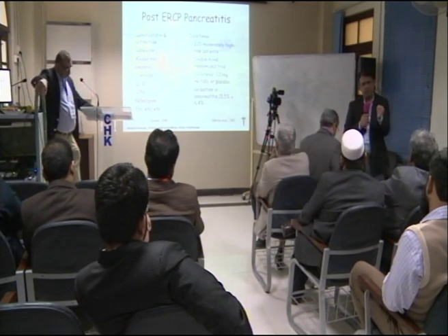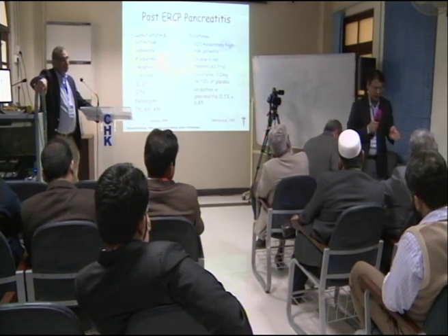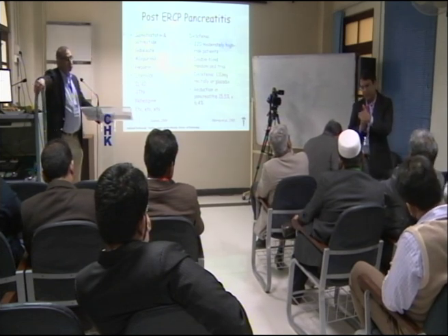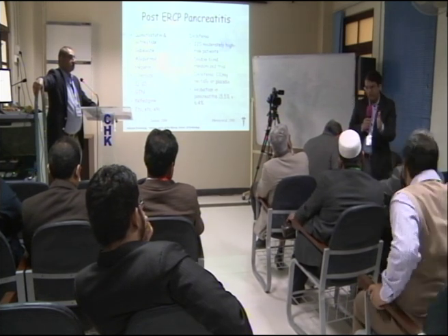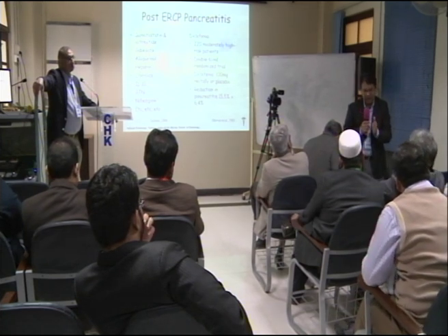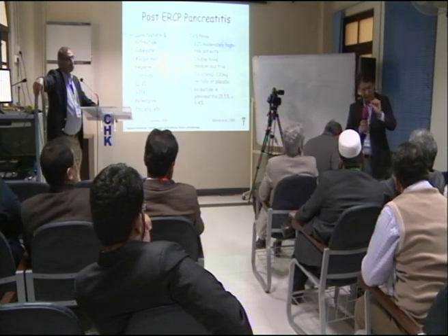And with regard to French, 7 French should never be put in the pancreas for prevention of post-ERCP pancreatitis. The bigger the stent, the bigger the diameter, the more risk of ductal damage. So I would either do 3, 4, and very few cases of 5 French because I cannot get through the neck safely, and I would not keep trying to get the wire through that area and cause more damage. In those cases, I will choose a very short stent, 2-3 centimeter, but 5 French.